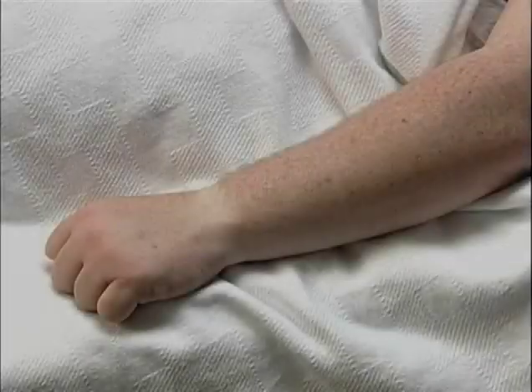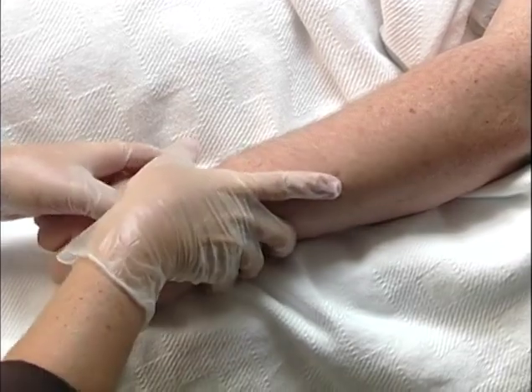Although rare, an injury to the radial artery limiting circulation to the hand is conceivable. Prior to accessing the radial artery, verify that there is sufficient collateral circulation of blood through the ulnar artery that also supplies the hand. The most commonly performed method is the modified Allen test. Perform the test as follows.